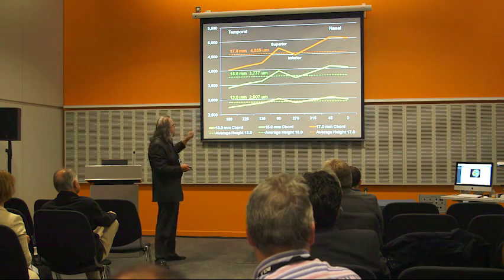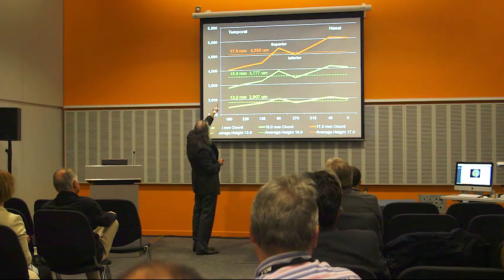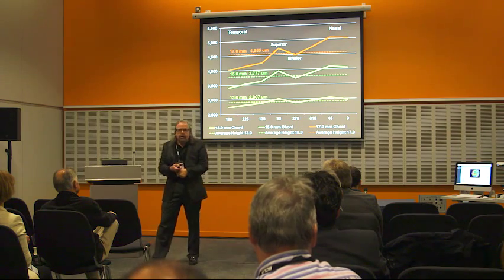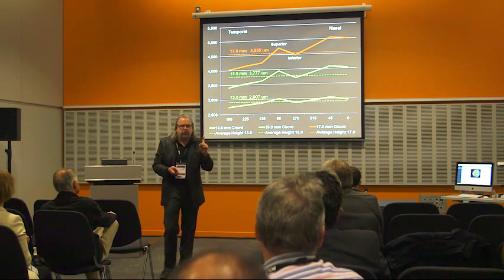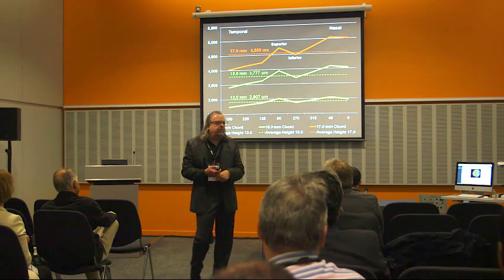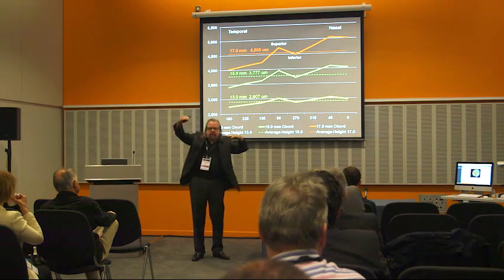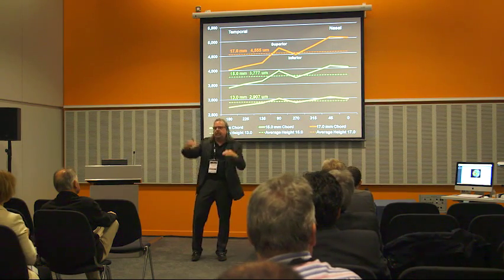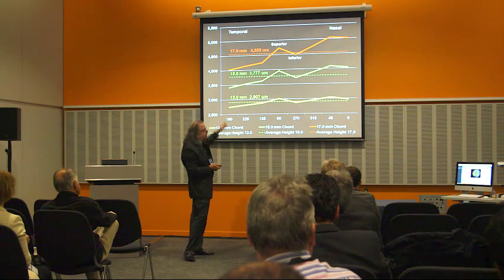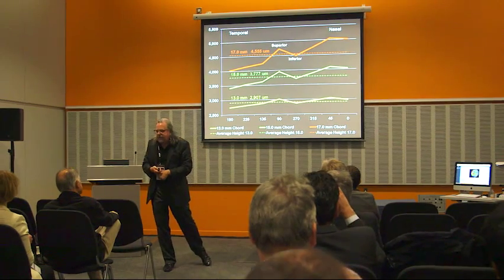So that's what we see here at chords of 17, 15, and 13 millimeters. One of the other very important and striking features of these data is the fact that the asymmetry, this height differential between the nasal and temporal sides, dramatically increases as we increase the chord that is being measured.